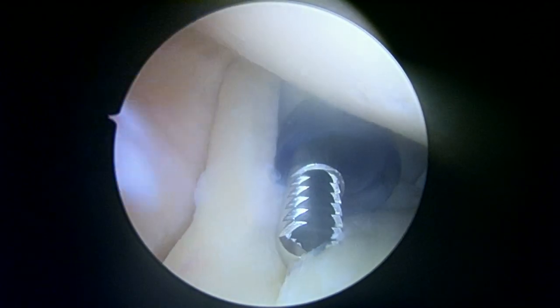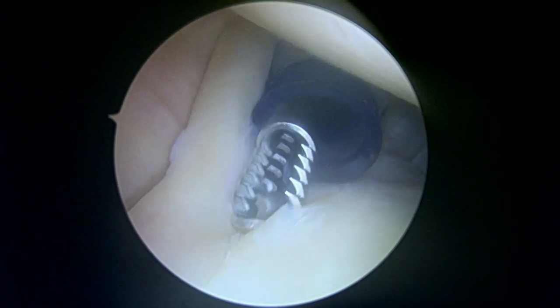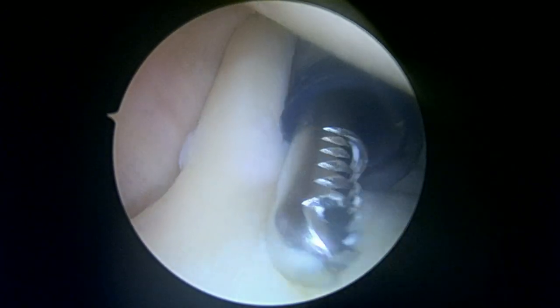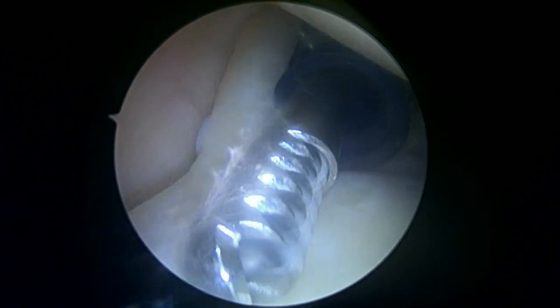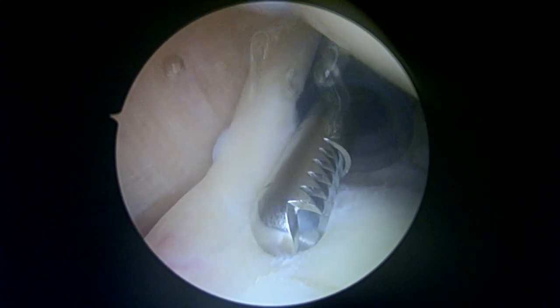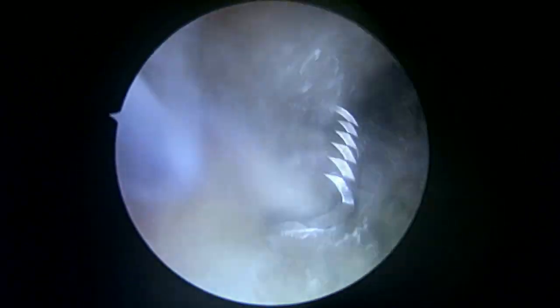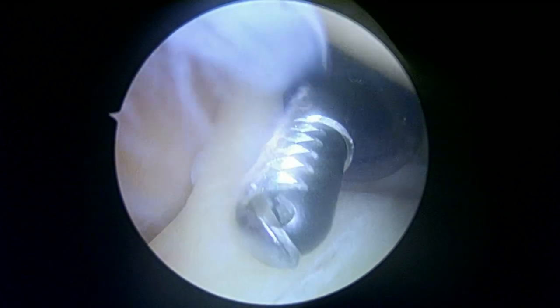Pretty much by definition, what we're seeing already is kind of a type 1 SLAP lesion, meaning there's some degenerative tearing. It almost rises to the level of being a meniscal type of injury like a bucket handle tear, which would make it a type 3. But regardless, this is what shows up on an MRI scan — it doesn't really show up great on ultrasound, but certainly on an MRI scan or an MR arthrogram. Like we talked about, we always have to have a look to see if it rises to the level of needing to be stabilized surgically, and so far the answer to that for me is no.